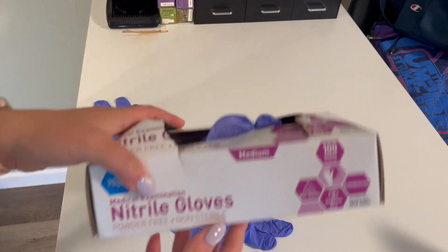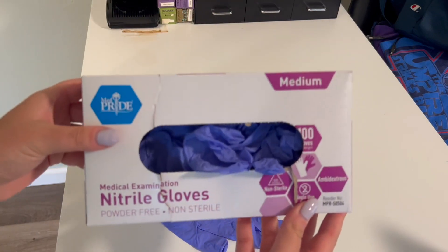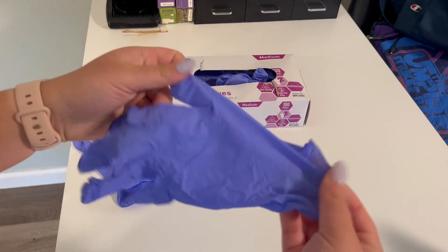Today we're looking at the MedPride powder-free nitrile exam gloves. I got a size medium, though they come in a few different sizes. These are what the individual gloves look like — they're just pretty typical standard blue gloves.